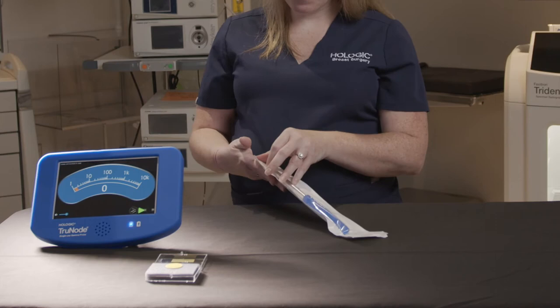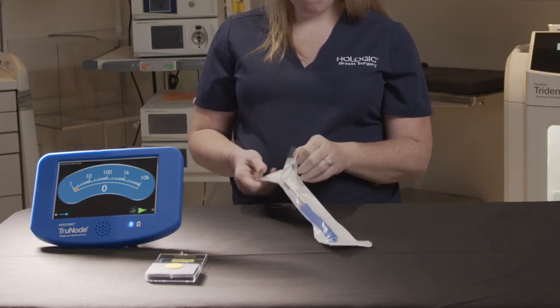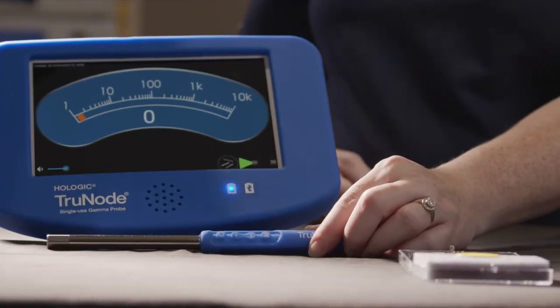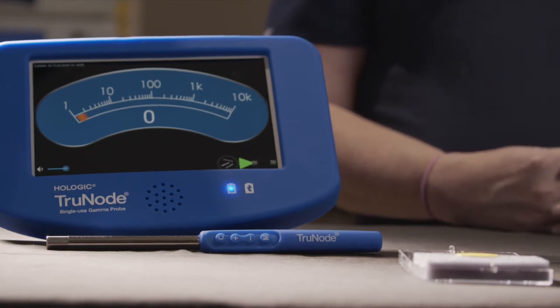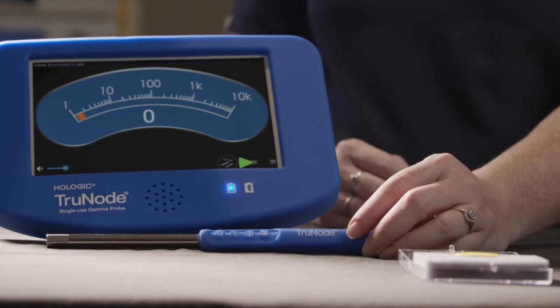So let's go ahead now and take it out of the packaging. The probe itself has four buttons that are on the handle: an M button to change the mode, a plus and minus button, and a C button which is going to give us counts. Each button on the probe has two functions: a short press and a long press.